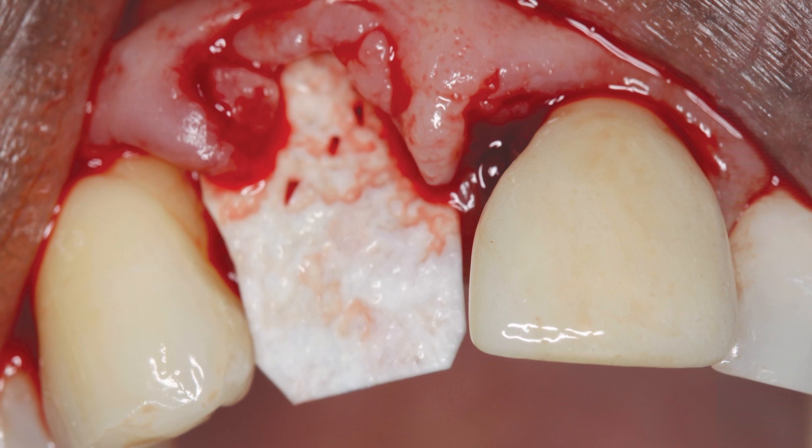A barrier membrane was then placed to prevent ingrowth of the surrounding soft tissue and to permit osteogenic cells to repopulate the bone defects. A resorbable membrane was passively placed on the facial aspect of the bone to act as a barrier. When grafting a socket or attempting to repair a facial defect, it can be challenging to properly position the membrane and prevent it from dislodging prematurely. Because the membrane must be retained passively to promote predictable bone growth, it is important to elevate the attached gingiva and mucosa to ensure the barrier engages the facial bone at least 2 millimeters apical to any defect. This rule should also be followed on the palatal or lingual side.